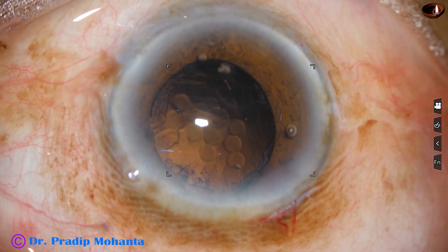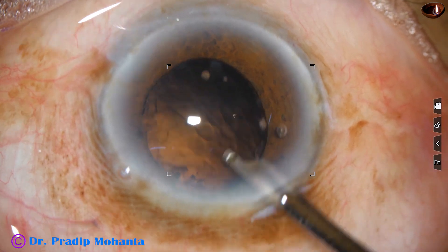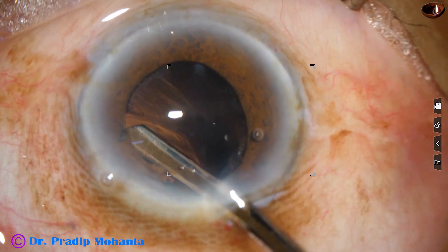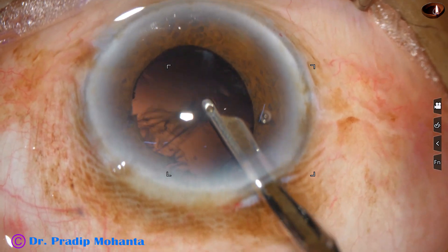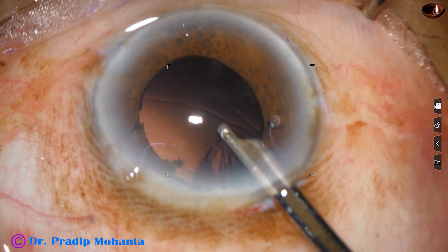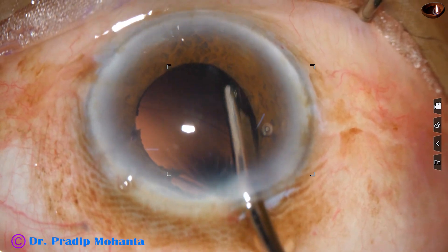Cortical cleanup is done with a 23-gauge Simcoe cannula. There is a lot of cortex in this case, and it came out very nicely.